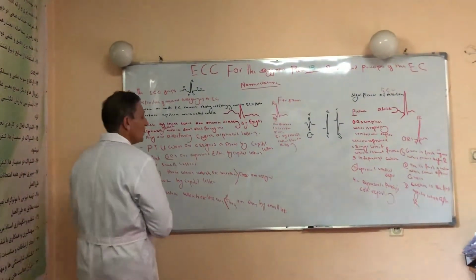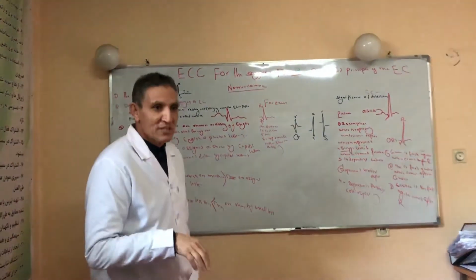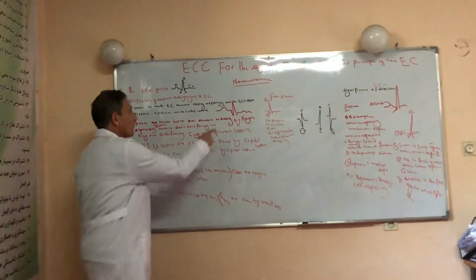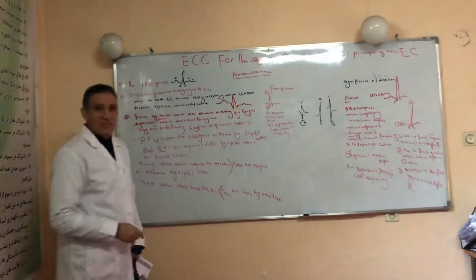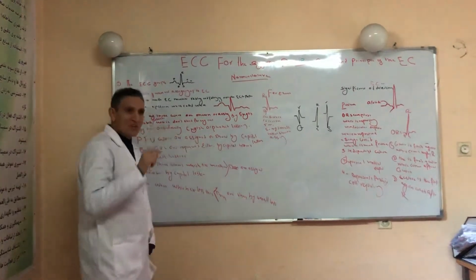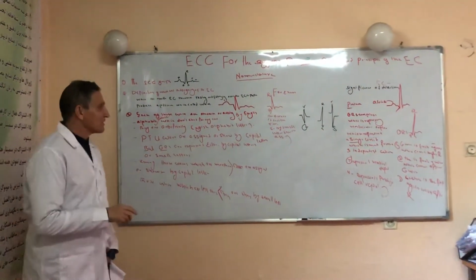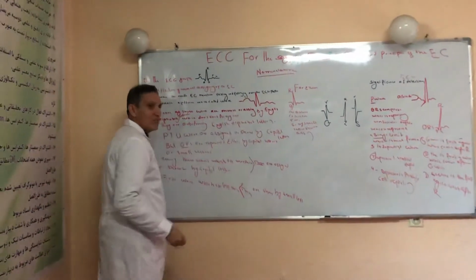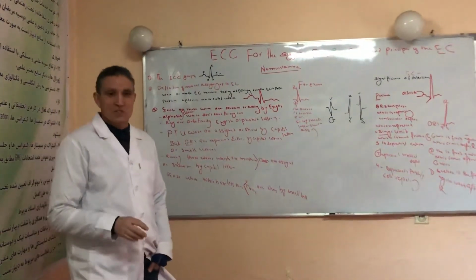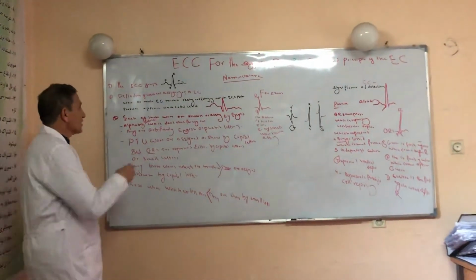What is the wave? When the needle of the ECG machine is raised and falls over the ECG paper, it produces a pattern which is called a wave. Or in other words, due to the up and down movement of the needle of the ECG machine over the ECG paper, a pattern is produced which is called a wave.